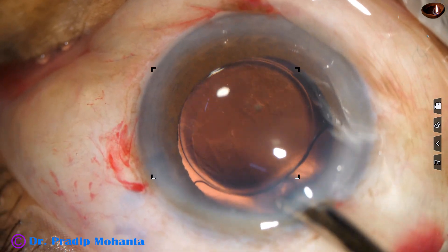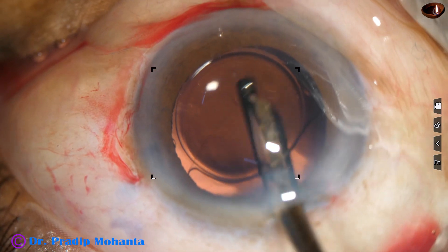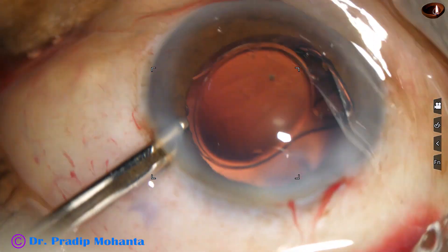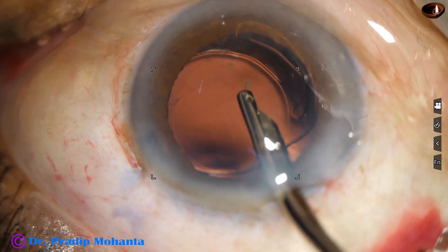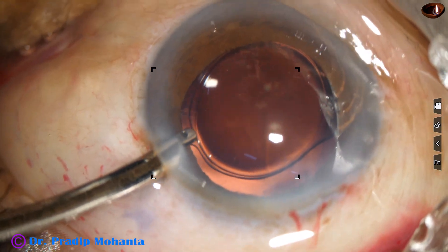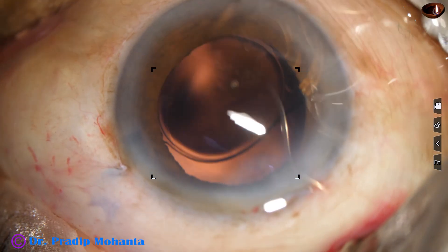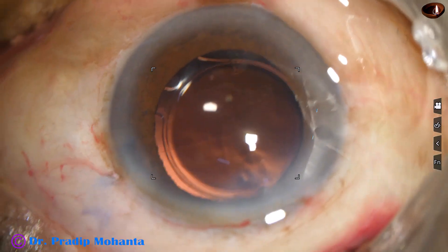First I irrigate with Simcoe. In this case, since the rhexis was quite large, as I went behind the IOL the haptic which was towards 9 o'clock came out. Yes, this can happen — when you go behind the IOL the haptic may come out, particularly when the rhexis is big. I tried to place it in the bag with the help of a Simcoe cannula; I then went with the Simcoe through the 7 o'clock side port and placed it in the bag.